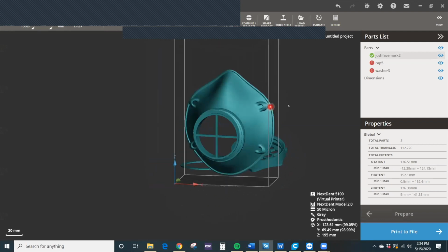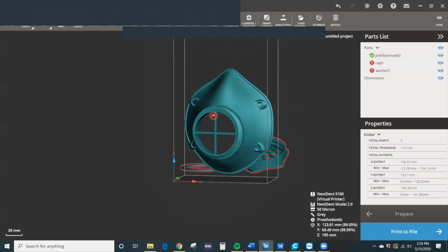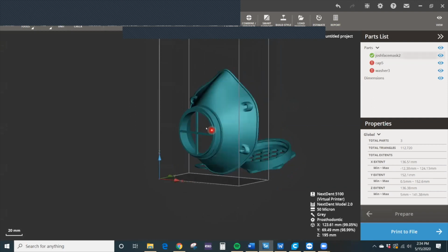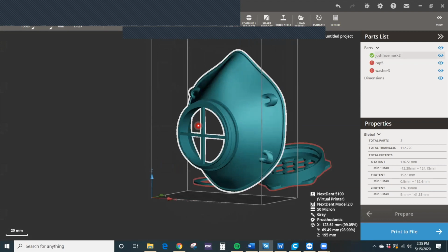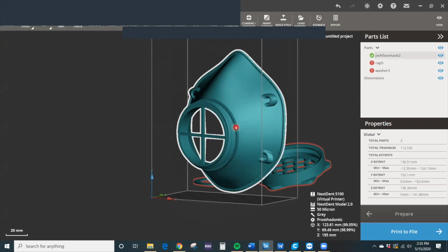So like I mentioned before, we actually increase the diameter of the opening where the filter is going to be laid out. The main reason for this was to offer breathability, so you can also exhale properly and there's no buildup of condensation. Right?